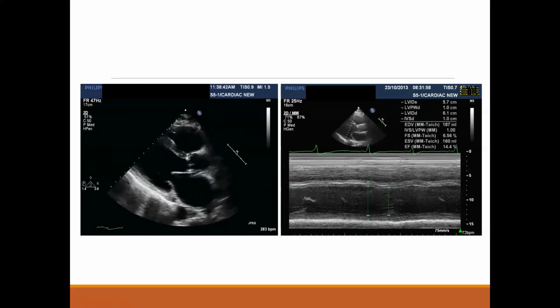Can I take it? Yeah, sure. This is a long parasternal axis view showing a dilated left atrium and ventricle, and the mitral valve looks malcoapting, giving a clue for mitral regurgitation, and maybe due to dilated cardiomyopathy. Very good. I think you have done most of it right.